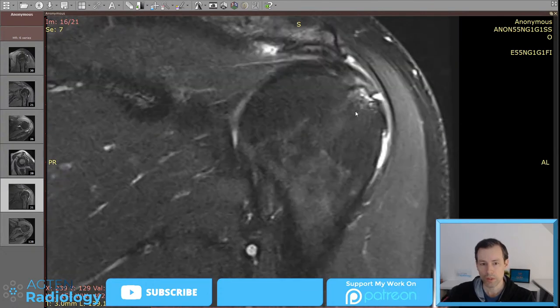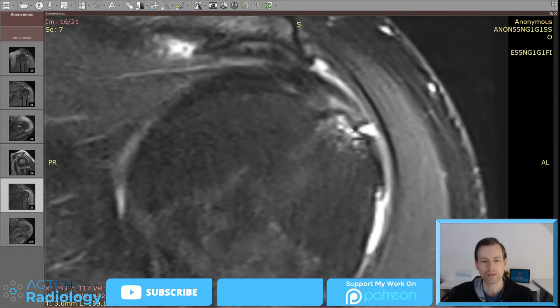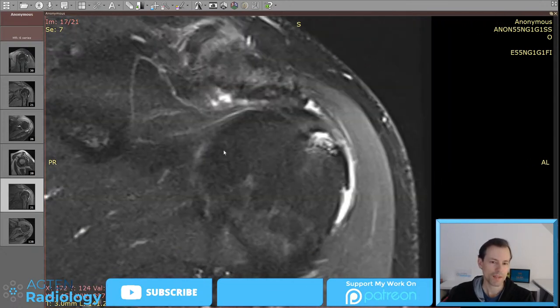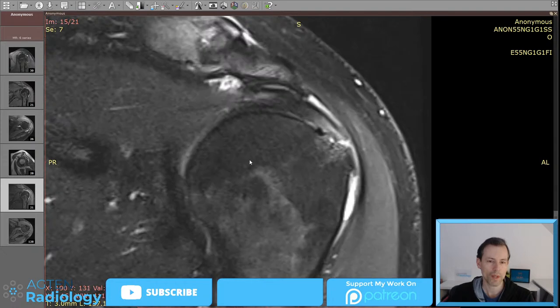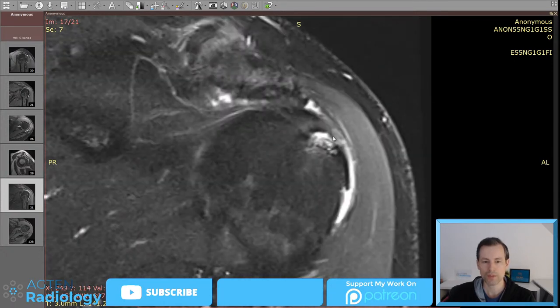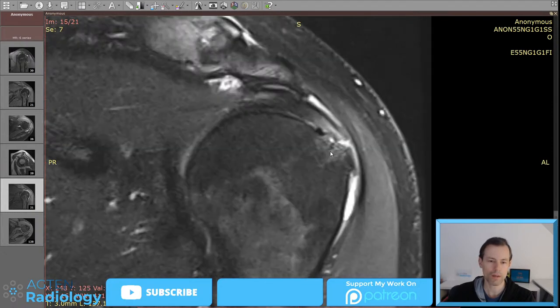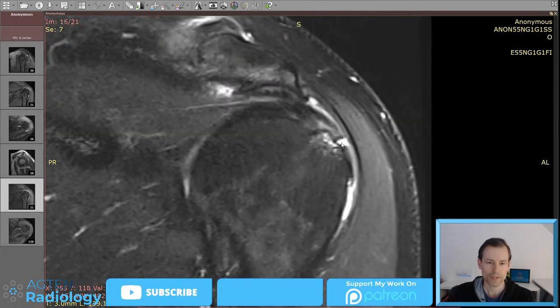Anyways, both tears are closely together, and you can see, or I hope you can see, that there is no obvious connection, and it really looks like this one is still attached here to the bone. Now, an arthrogram would be very useful in such cases. Initially, I wouldn't recommend doing one now, because the tears, even if they don't communicate, are in such close proximity that it could be relevant. And even this one here is quite extensive. So if they go in and do the repair, they will just make this connection automatically during surgery and tuck everything back in. So that was basically the question here.